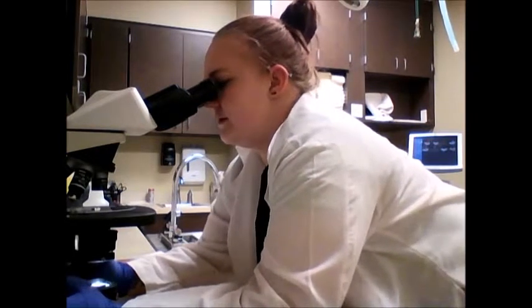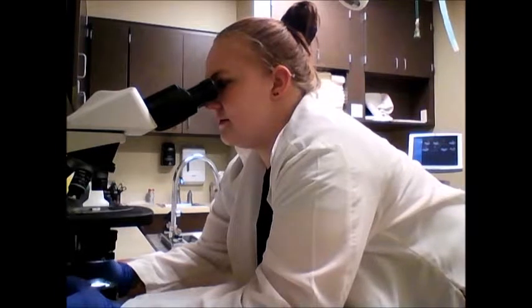Yeah, it's really good cytology. You can clearly see where she's at. I would say, based on the cells, how I see them right now, that Wendy is in diestrus.